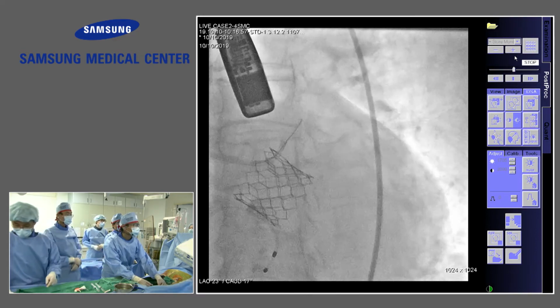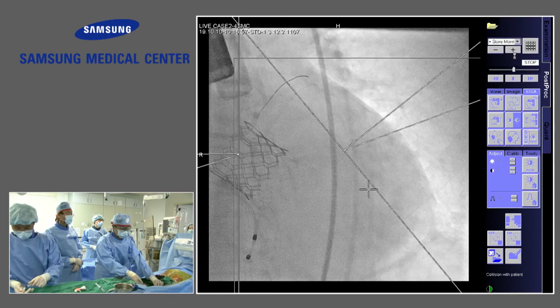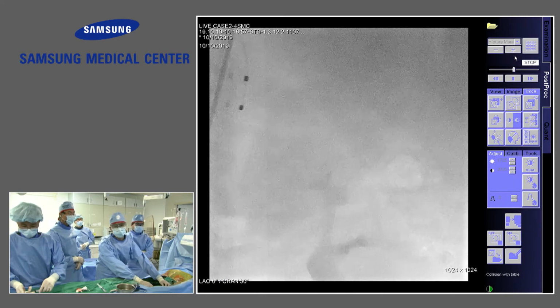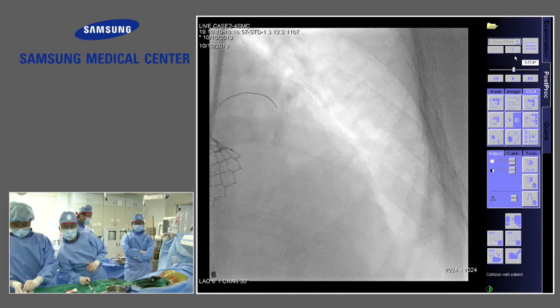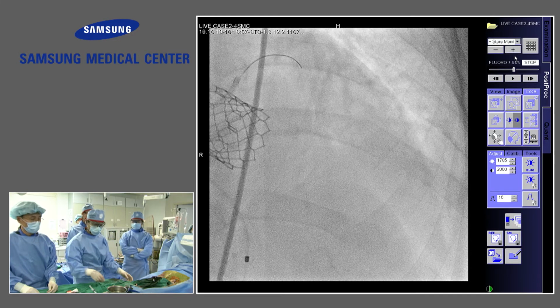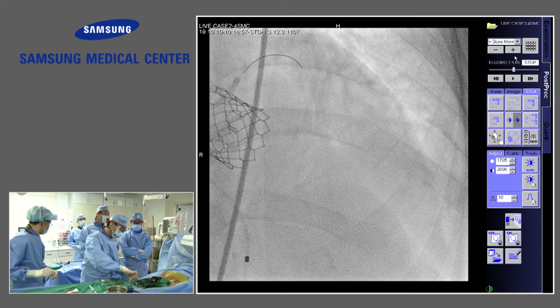I think most of the audience have interest in that one, rather than the TAVI procedure itself. TAVI is boring with the Sapien valve. It's always a short calcified lesion, no bifurcation, no CTO.